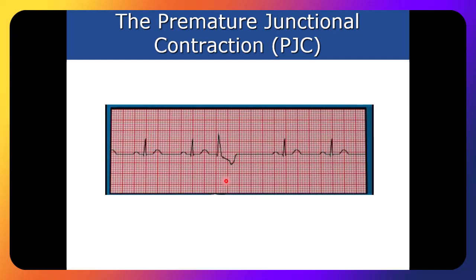Same way with PJCs. Same with PVCs when we talk about them next week. Most always you'll have a compensatory pause with a PVC, and we'll talk about why that is. Again, in that regard, you may or may not have a compensatory pause, but you will see that.